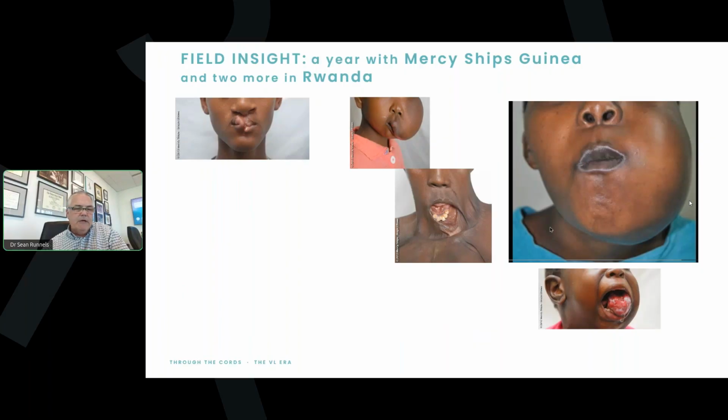So personally, I gained some insight and started really thinking about difficult airways. I spent 3 years in Africa, 1 year working for Mercy Ships in Guinea, and 2 more in Rwanda. In Rwanda, what I saw was that all of our airway disasters had the same pattern. We used direct laryngoscopes because that's the majority of what we had as far as laryngoscopes.